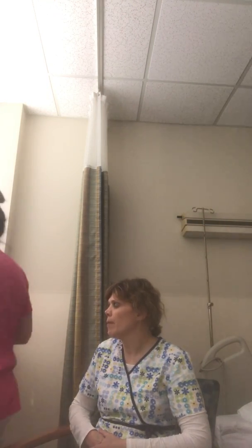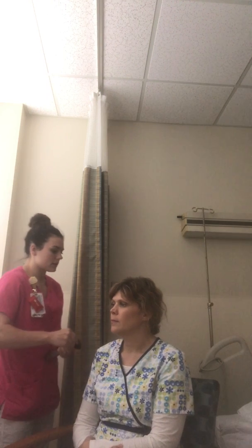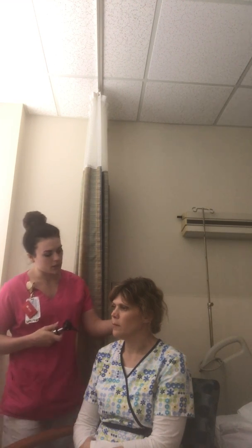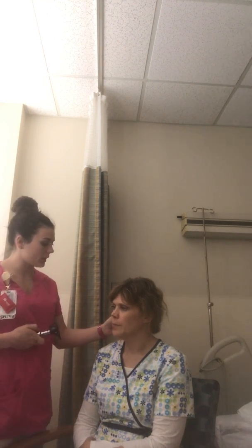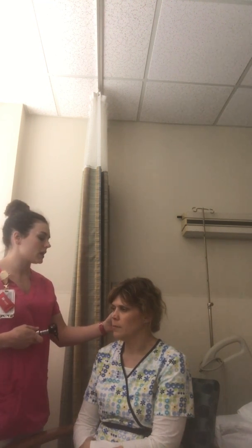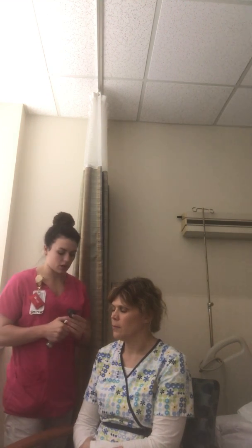We are now going to look in her ears. First, we are going to look on the outside of her ears and notice that there's no lesions, no cauliflower ear. They're symmetrical. Her tragus is intact and it's movable. Is there any pain with that? Her pinna is soft and flexible. There's no drainage noted, so we're going to look inside the ear.